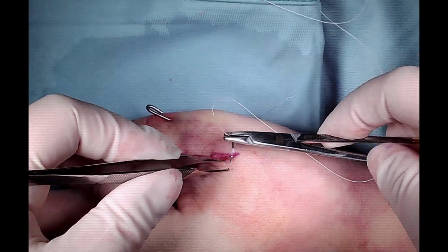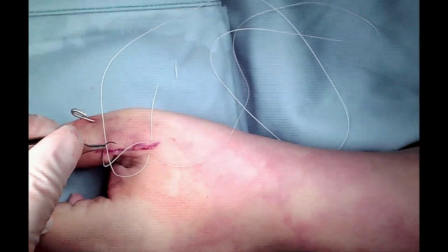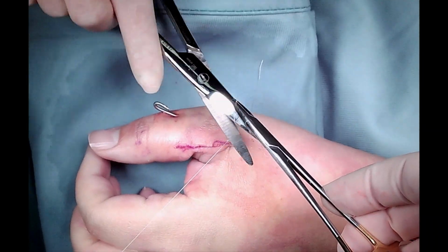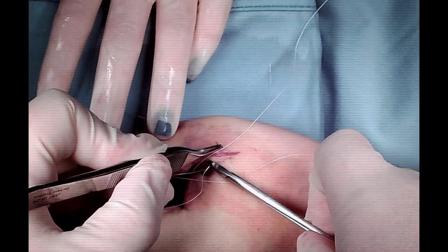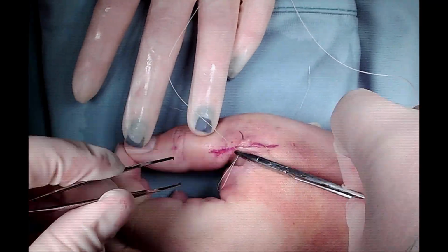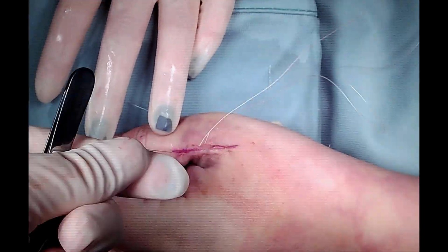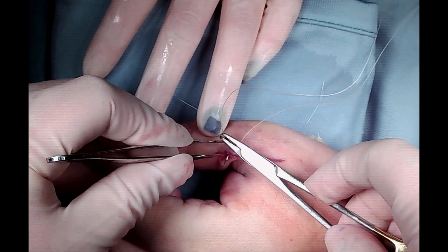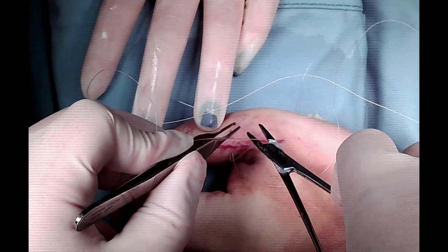So in this case, an acute injury to the UCL is treated with the help of anchor reattachment. We used a pin here to protect the repair. We utilize the fluoroscopic view in order to see that the joint is congruent, and we put the MP joint in 30 degrees flexion, and then we did the repair later. We will not be putting a cast on the finger, only a bandage.